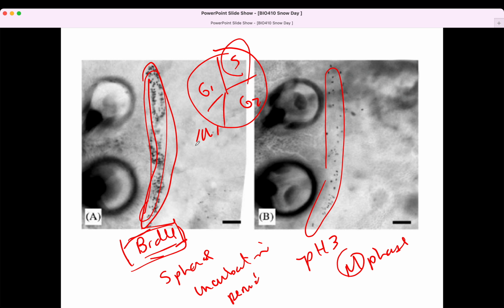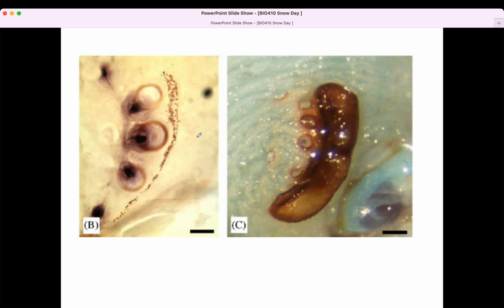And so a big thing for lab 3 will be to focus on learning this immunohistochemistry method. It involves dissection and then this staining. Staining with these antibodies involves several incubations, including overnight incubations. So we'll try to compress that all together. Here's just another picture of that result. And I just wanted to show you this.